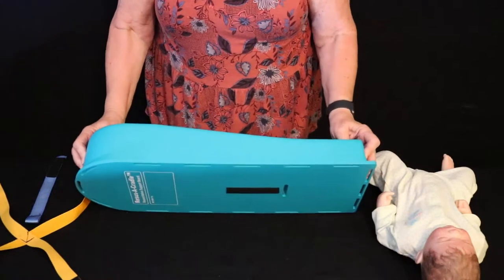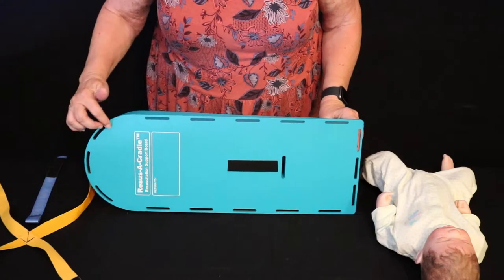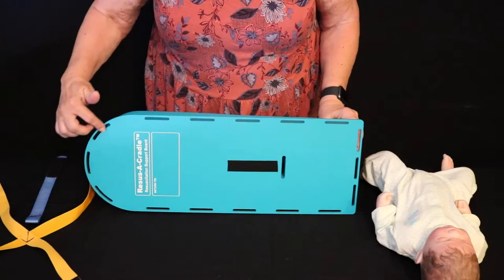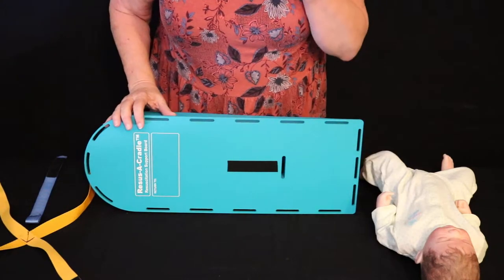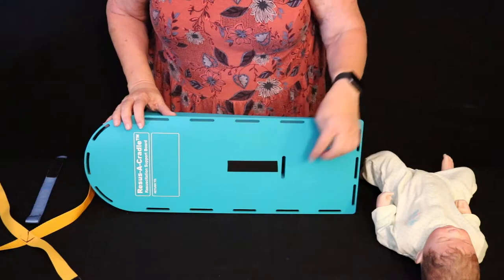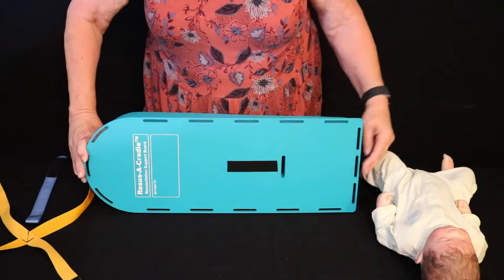This is the ET2, the second version of the Easy Transport Cradle. You'll notice the biggest difference is that there are three slots at the top and three slots at the bottom. Additionally, there is a crotch slot that allows us to use that fifth point and Velcro to stabilize it.